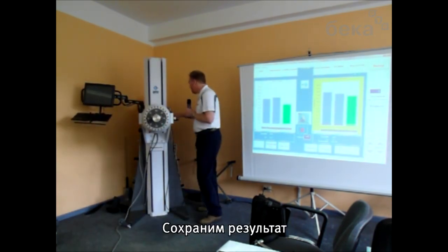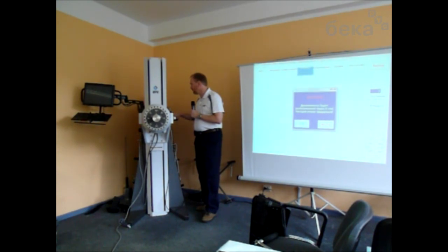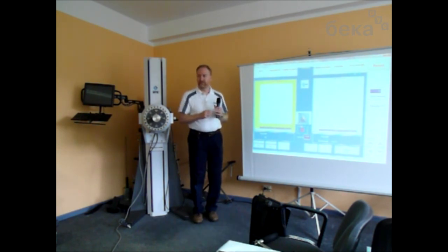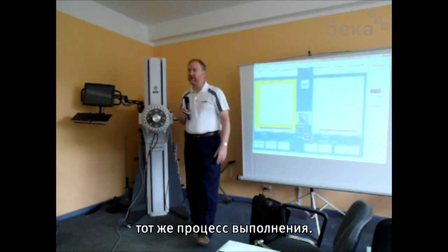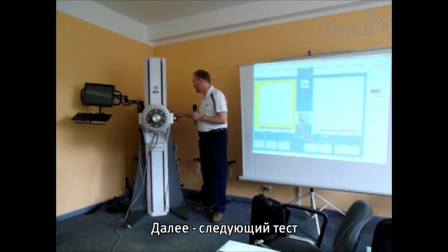So we would save the results. Which is the same tool, but now we do left. So then you would set them up and do the same thing, left, supination, pronation, back and forth, same process. And then next test, take you to the next one on the list.